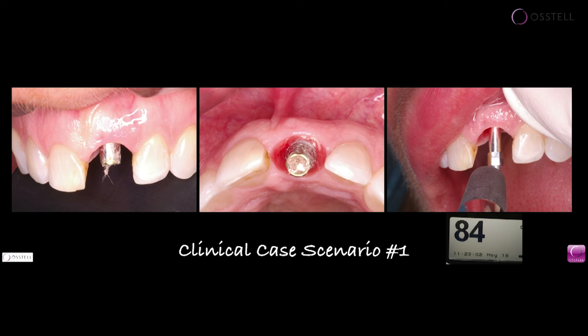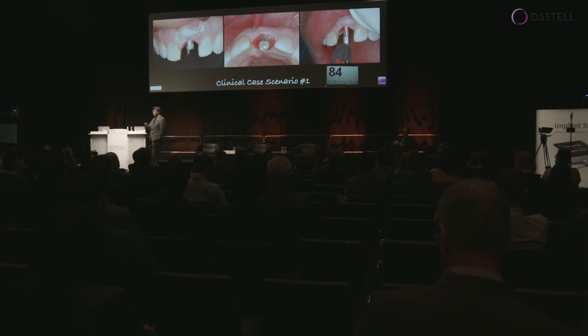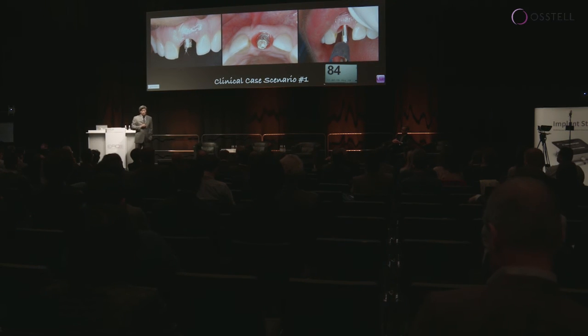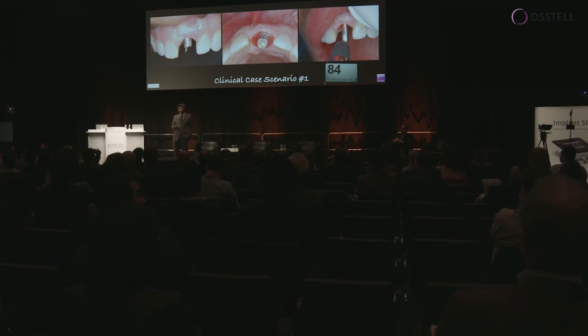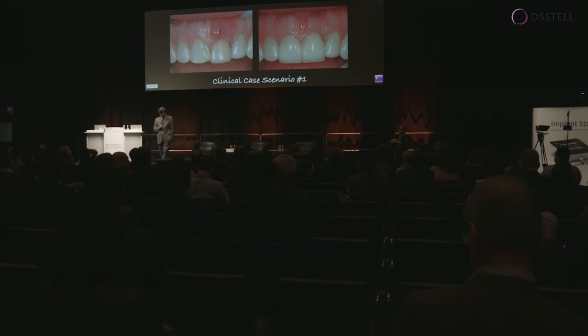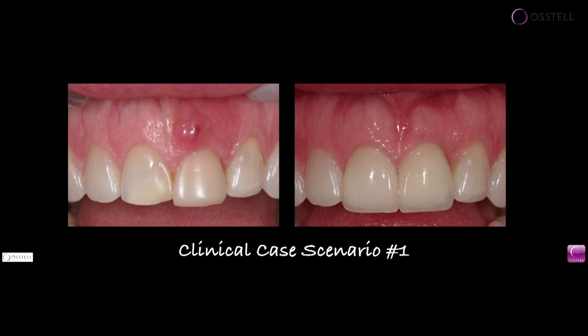Now, what does that tell you? You've gone from a 73, 78 to an 84. It tells us that we've reached biologic maturity, right? We have achieved now biologic stability and have transitioned out of the mechanical. So now you can do whatever you like with that implant because it's stable and it's going to hold up. And there we have it at 3 years follow-up.